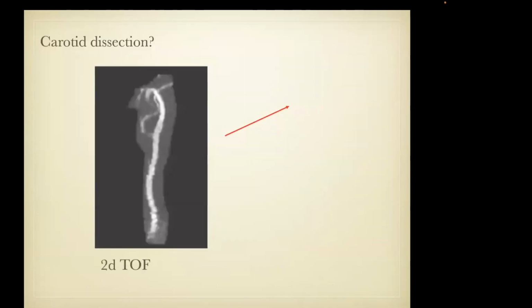Here's another patient. If we look at this carotid, again, stacked coin appearance, this patient is not overly cooperative, but our single slices are being stacked together here. And you'll notice that in this portion of the external carotid artery, we have some signal loss. This is where the vessel is in plane. So we have less flow-related enhancement because the direction of flow is in the same orientation as the acquisition slice.